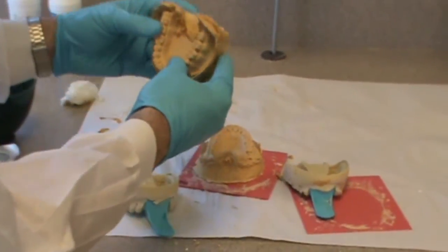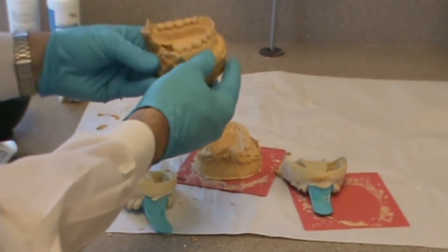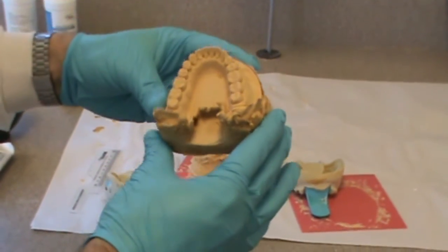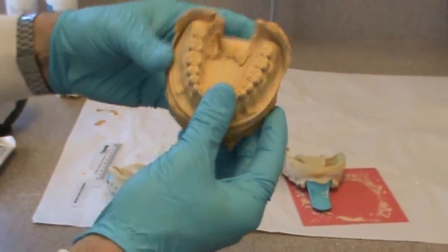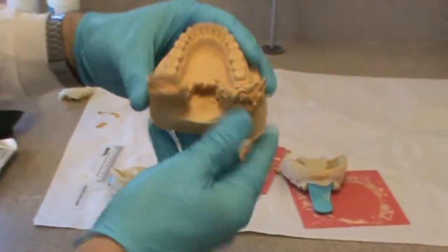We'll evaluate the teeth, make sure we have no voids. We'll evaluate the anatomy, make sure we've captured all the anatomy that we captured in the impression. There are little tiny air bubbles on the occlusal surface of the teeth that we will remove. And I'll show you the air bubbles in the vestibule.